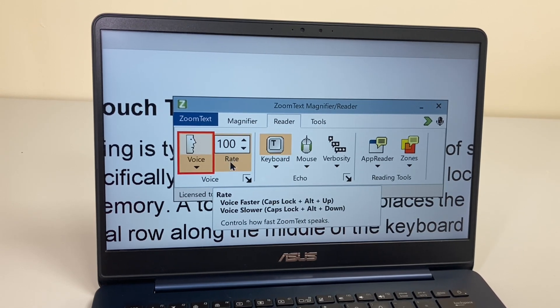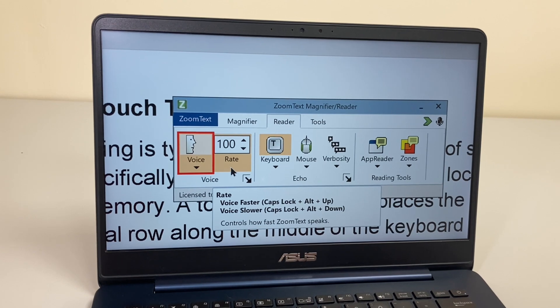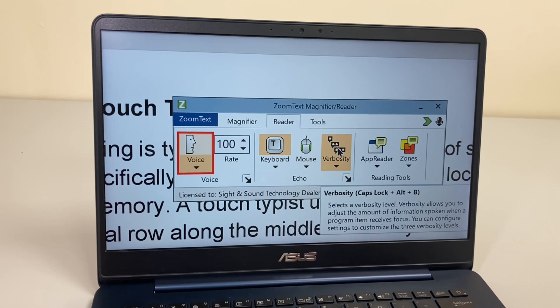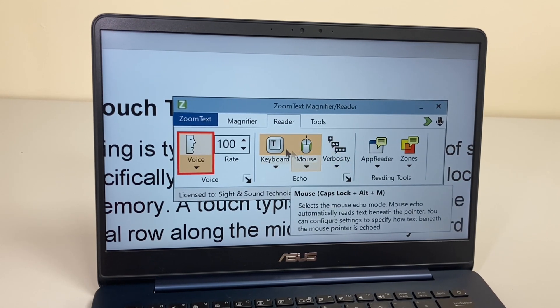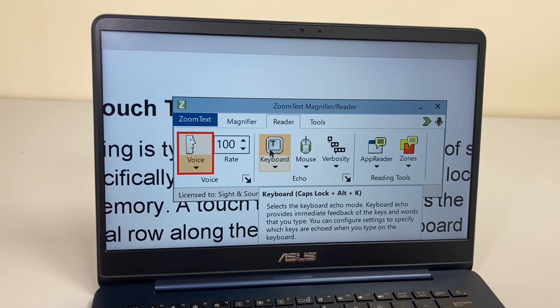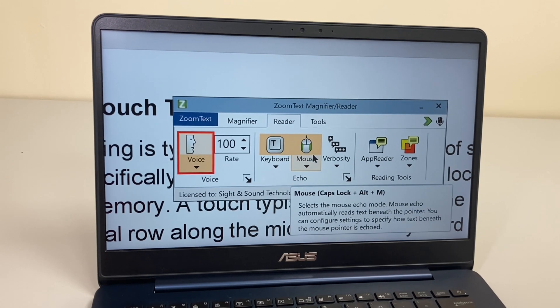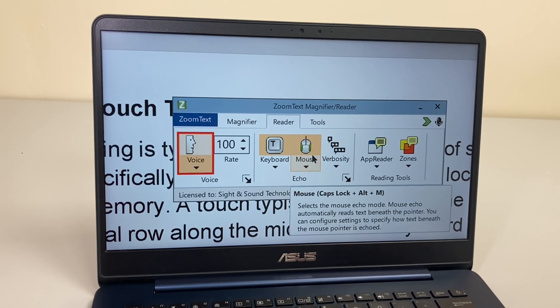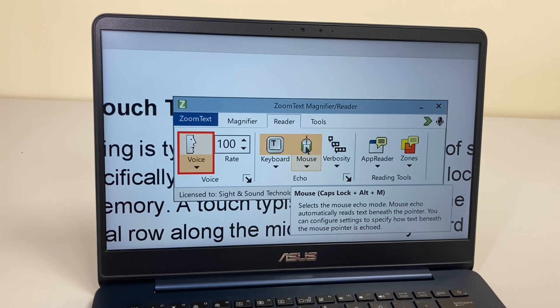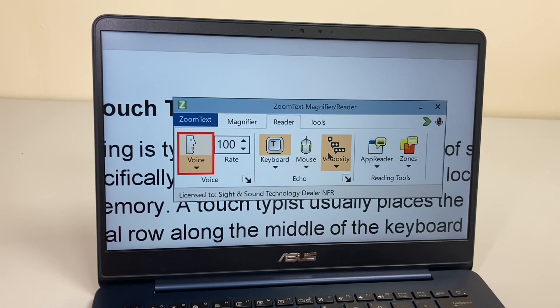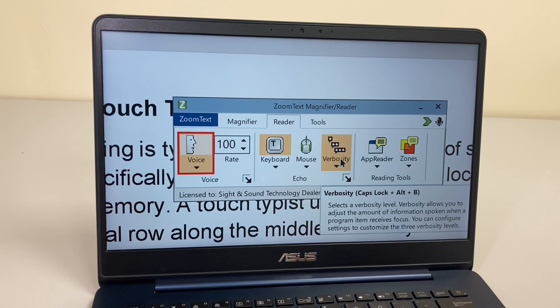The options we have here: we can change the rate, and we can also do that with a shortcut, so we can make it a bit slower if we need to listen more carefully. Then we have different echo settings. The keyboard echo controls how much ZoomText says when you're typing. The mouse echo controls how much ZoomText speaks when you're moving around with your mouse.